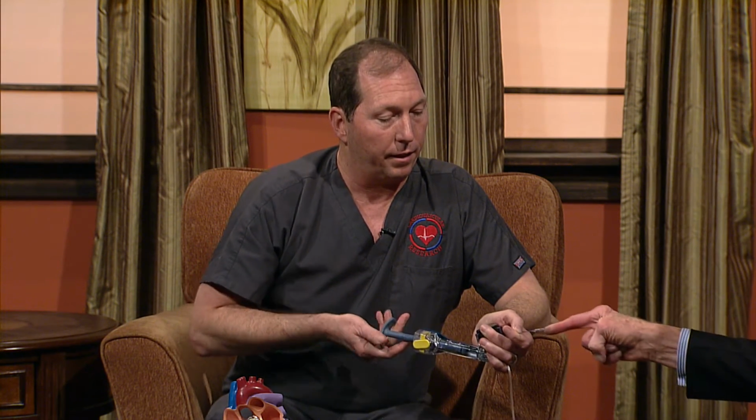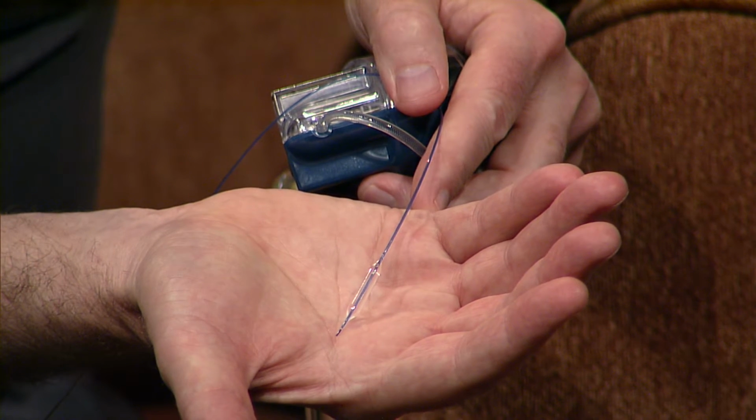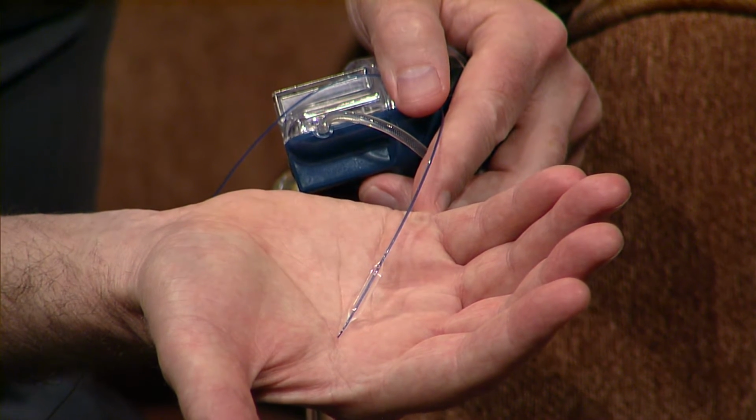So the stent is very delicate. We expand the stent just like that. So this is the stent right here. That is a stent that would go in a heart artery. So that goes in the middle of the artery, and then you blow up the balloon with your tire pump. Correct. And that opens it up and does the stent, which is metal, that immediately goes out and opens up? It does. The stent stays, then we deflate the balloon, and the balloon is removed. So the balloon is just in there long enough to expand the stent. The stent is permanent. I think that's so amazing.